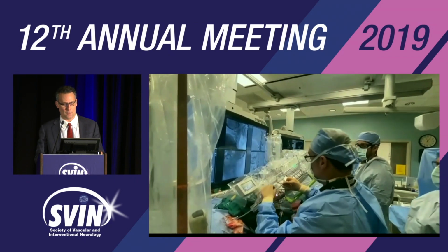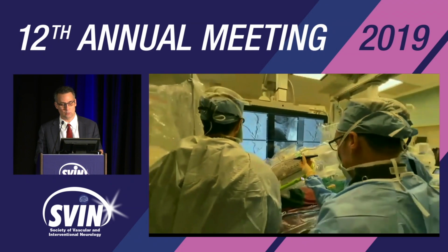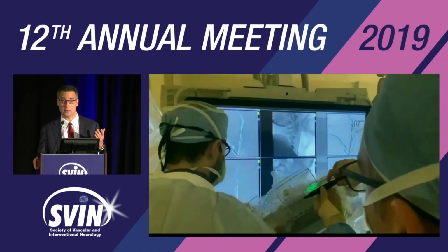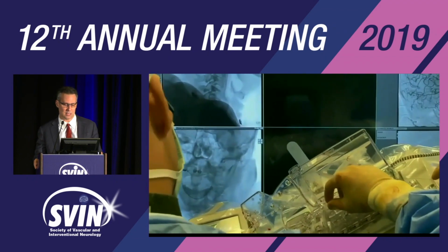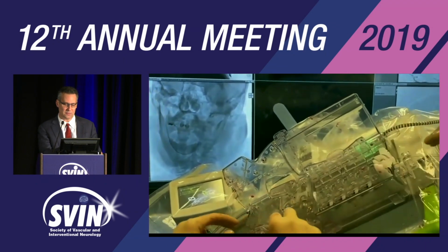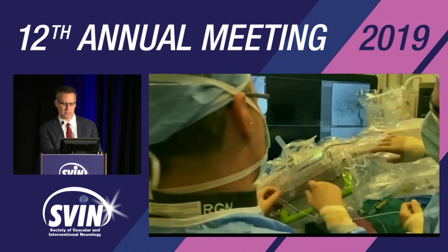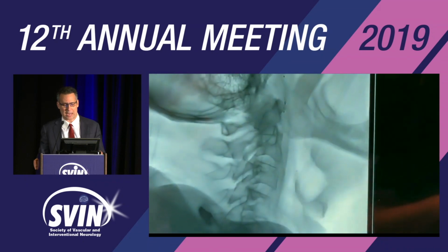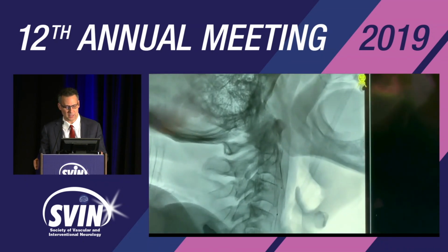Now, after the angioplasty, you are removing the angioplasty balloon. The stenting still has to be done manually because the system is too small for a carotid stent at this time. You can see here that the RX system works very well with it. Here is essentially loading the recapture of the Spider. Okay, so it works very well for the RX system. And then I'm recapturing the Spider now with the robot and removing it.